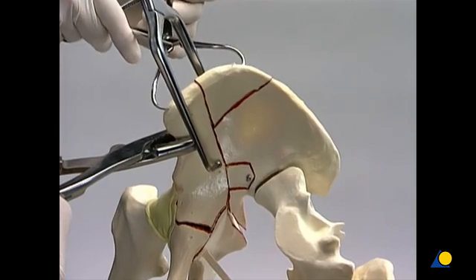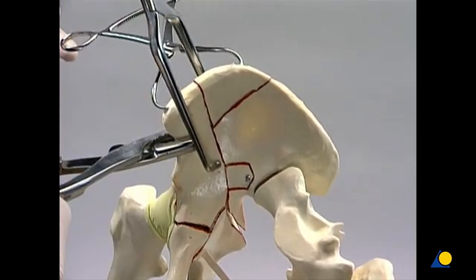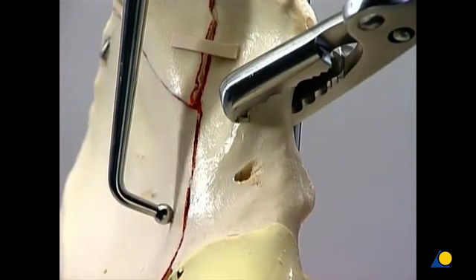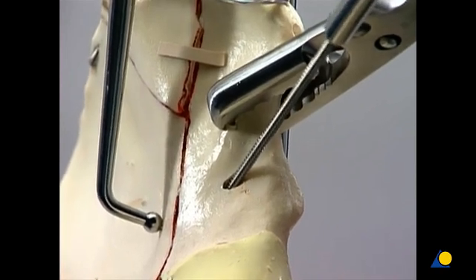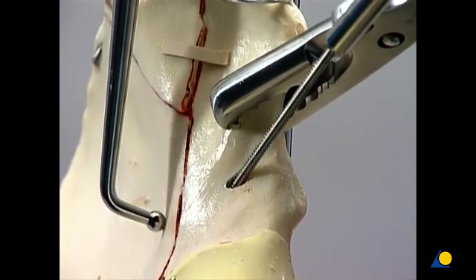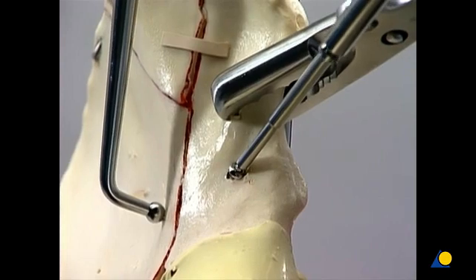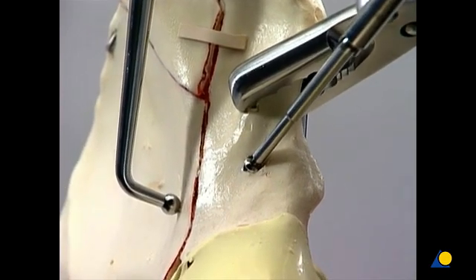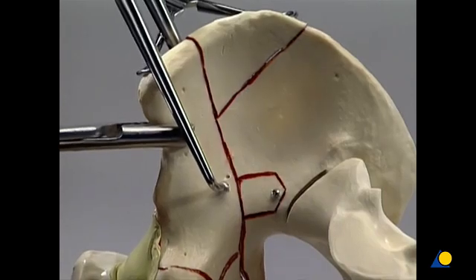The pointed reduction forceps is used to maintain anatomical reduction across the superior fracture line of the anterior column. The anterior column is secured to the iliac wing with a lag screw whose trajectory begins lateral to the anterior inferior iliac spine. The screw is directed into the posterior innominate bone, just lateral to the sacroiliac joint. In young hard bone where there is good screw purchase, the far cortex does not have to be perforated. The Faraboeuf clamp is then removed.